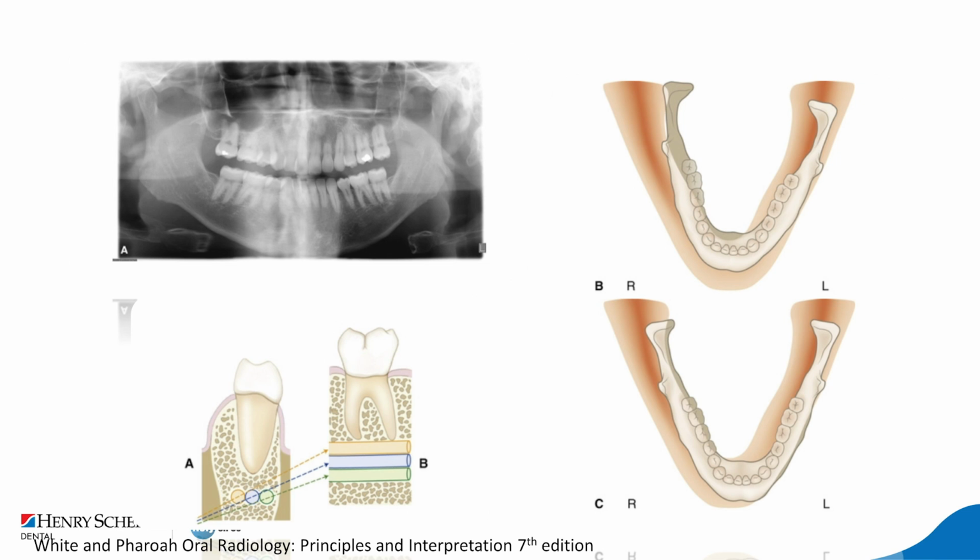Another very important thing to remember is that a panoramic radiograph is not a good exam to assess the length for future implant sites. It's not a good radiograph to treatment plan implants because, again, like I showed you a few slides ago, if you have a radiolucent area, the angulation of your beam might make it impossible for you to see. And same thing for the mandibular canal.